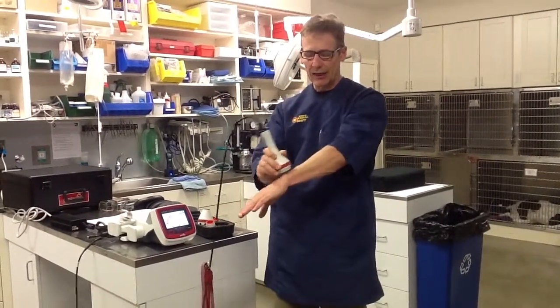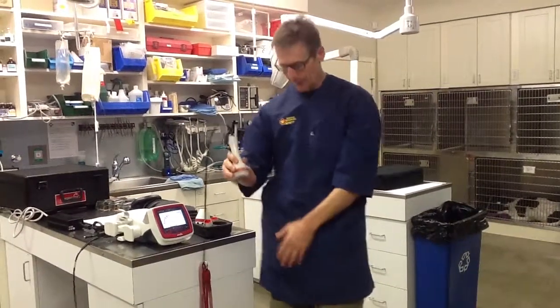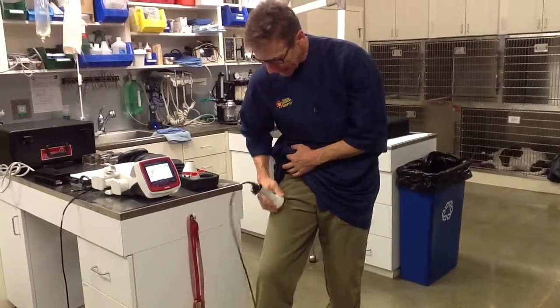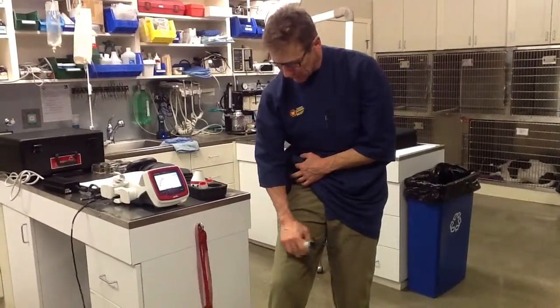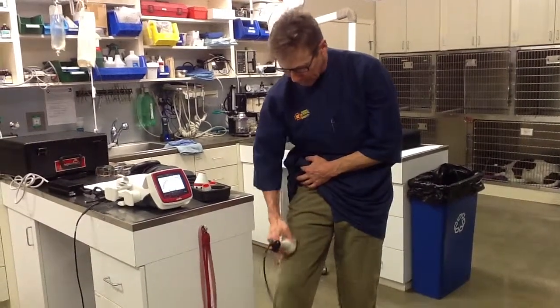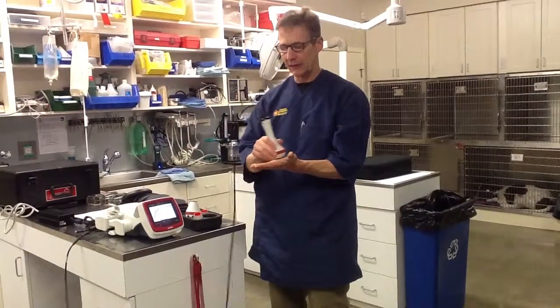If you can go 50-50 on directions, that's great. I probably go two-thirds longitudinally on a long area and one-third in the horizontal method. When you're doing the back or the thigh, that type of area is a lot easier to do a very symmetrical grid-like pattern. You do want to follow a grid-like pattern — no circles, no figure eights, no zigzags. That way you get consistent application of the laser light, regardless of which technician or doctor is applying laser therapy.